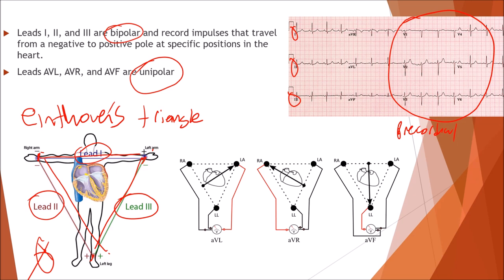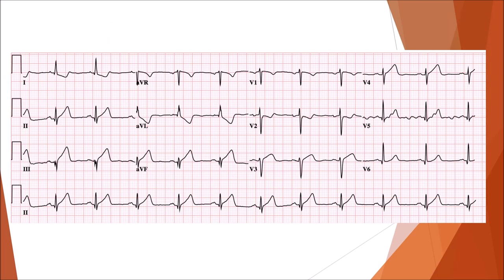It's in the fifth intercostal space, left mid-axillary line. Make sure you know those. I included this image here just to show you what an EKG looks like, but if you're not trained, you might not really know what you're looking at here. This is actually a heart attack.